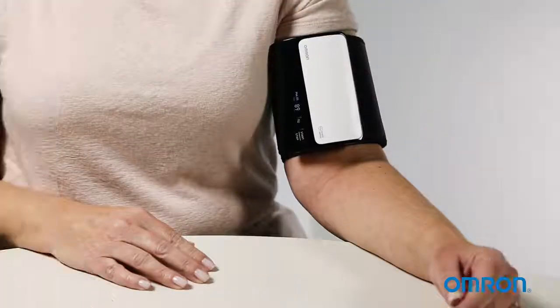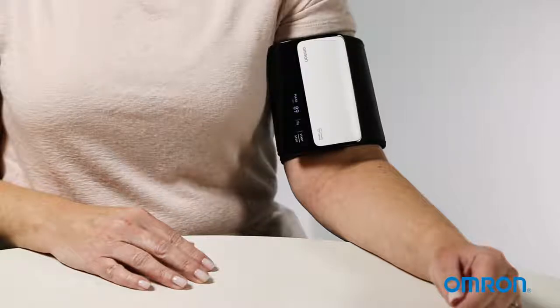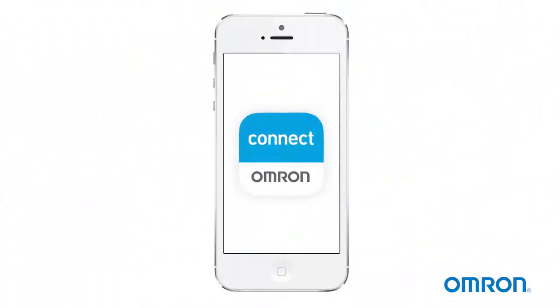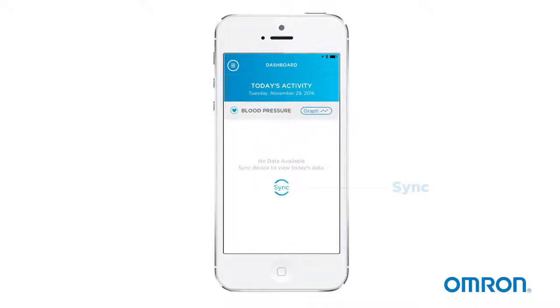Remain still until the cuff automatically deflates and your readings appear on the monitor screen. Make sure to record your readings or transfer them to the app. To start the transfer, open the app and tap the sync button.